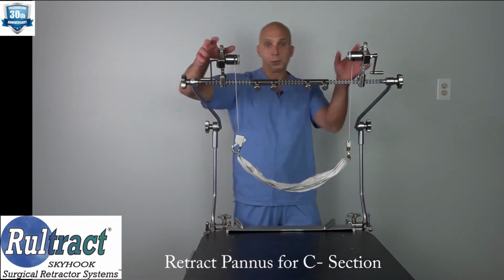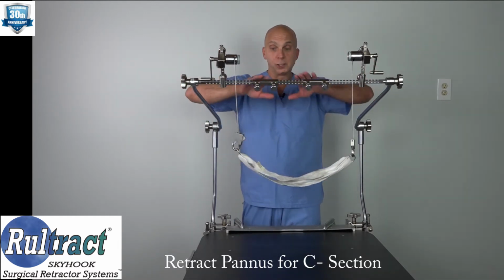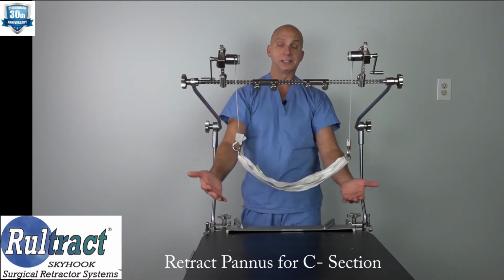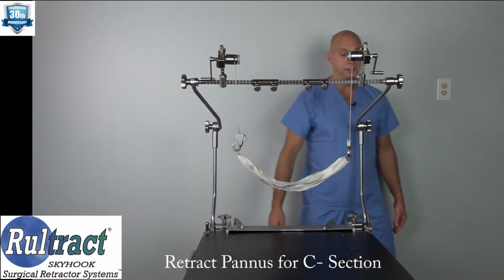If you don't want to use these, we can also just suspend this piece. Something else that we can do is actually drop this low enough to rest the pannus on it. But then I'm afraid that it'll be in your way. So that's what I've come up with so far.